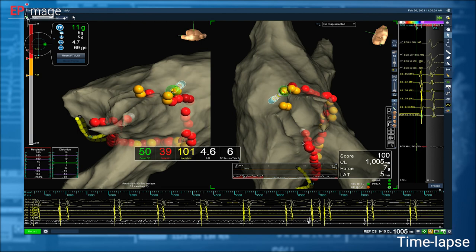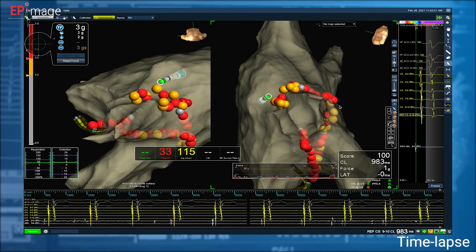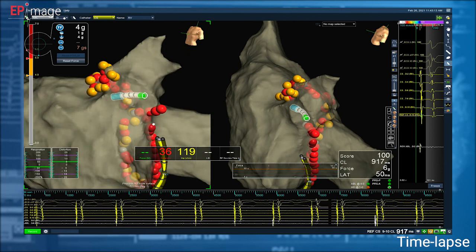So now you see we're just a bit speeding up the recording just to show you that we will close the isolation of the left pulmonary veins soon.